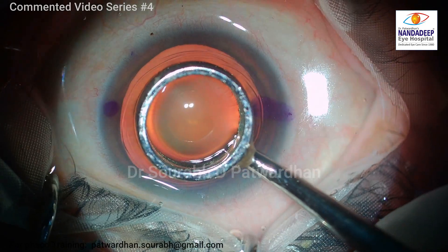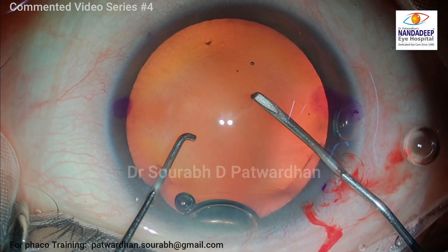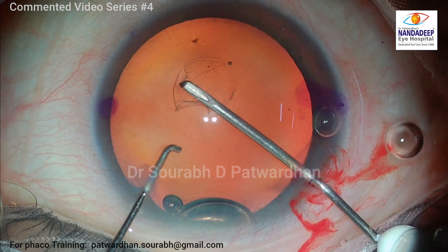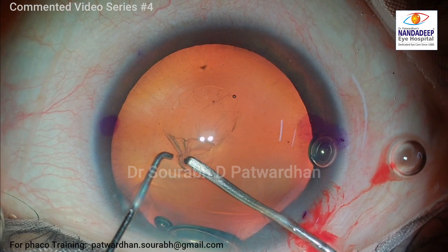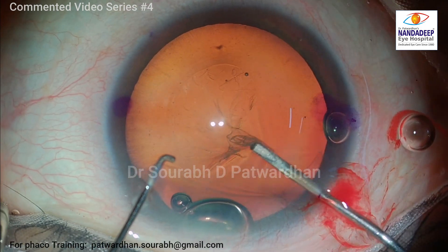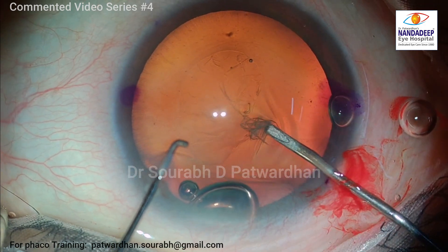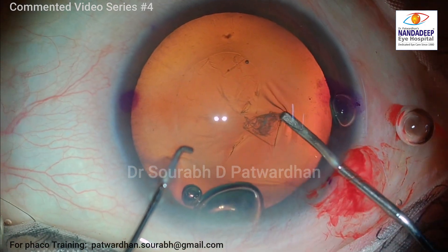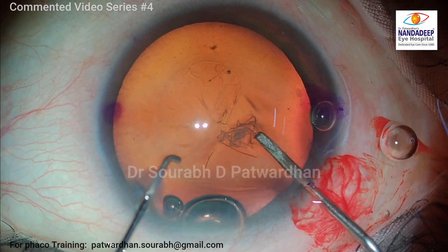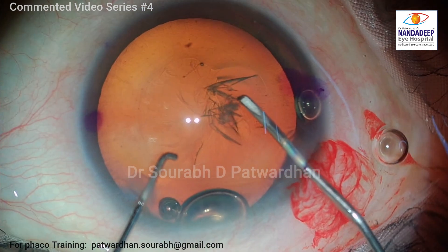For trifocals, as far as possible, we have to do a good centered CCC covering the optic. That's why I am using a CCC marker of 6mm size. This marker is particularly useful when the pupil is very well dilated because you tend to misjudge the size of the CCC. I am doing the CCC using the Hilu Coat, and you can see the flap is staying flat on the anterior lens surface because of the high molecular weight Hilu Coat, which is similar to Viscode. I could do the CCC along the marks, which are very thin but visible on the corneal epithelial surface.